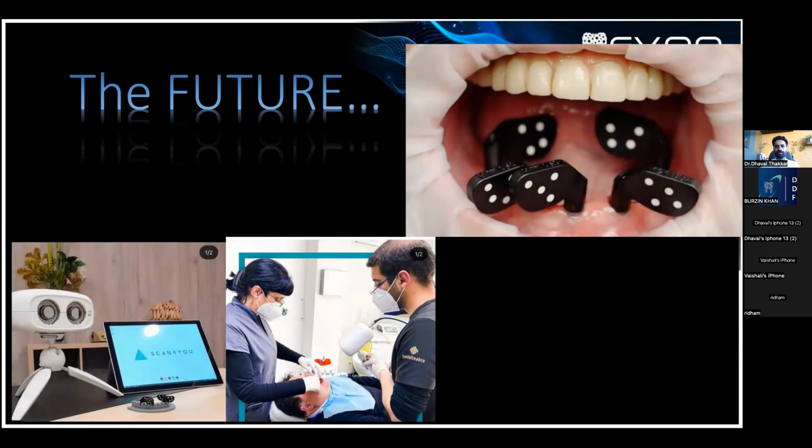There's a big camera system where we can do extraoral scanning of the particular implant system. Basically, it records the position of all implants in a single click, where we don't need to scan each and every scan body again and again. So that's the future that is going to be introduced in India real soon.